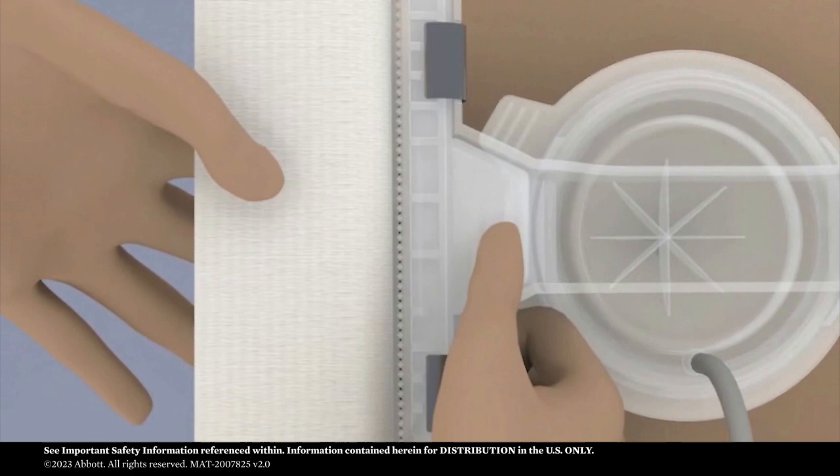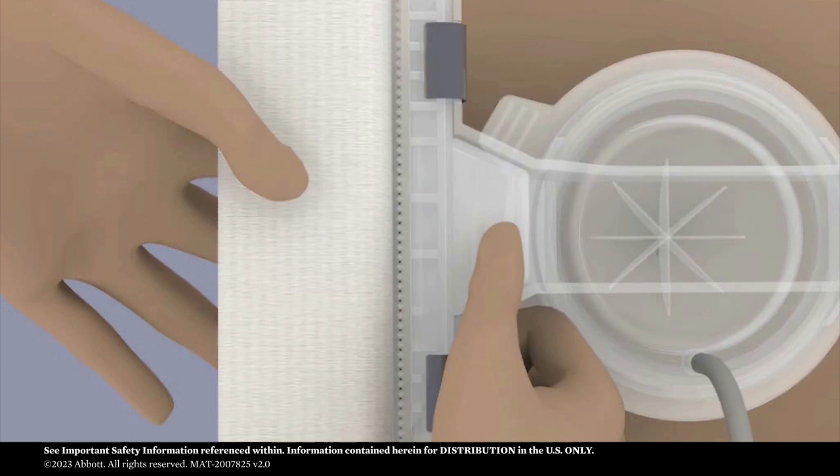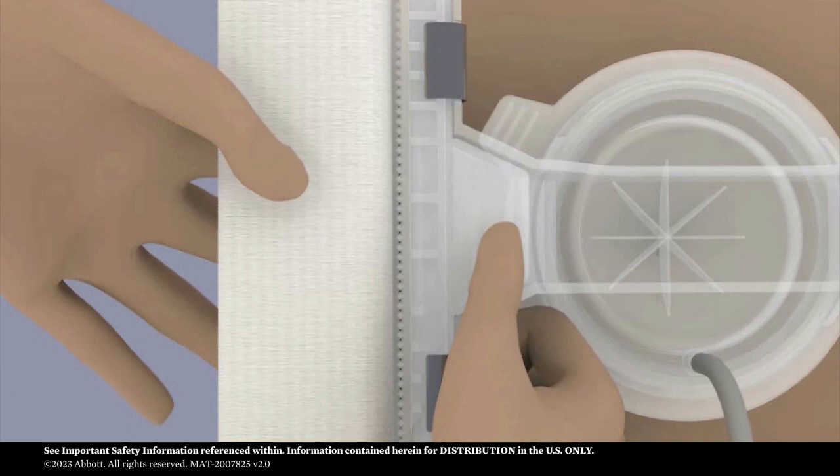After a few minutes of observation at zero pressure, carefully loosen the belt on the puncture site side of the patient without totally removing it from the arch, and gently roll the dome. Without completely removing the belt, move the arch so that it is clear of the area. This will allow better visibility and still provide the contact needed to quickly reposition and recompress the site if needed.